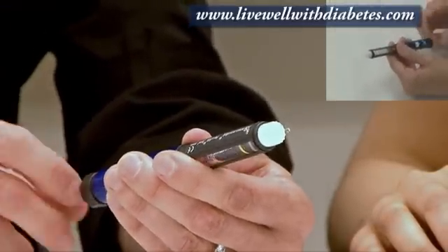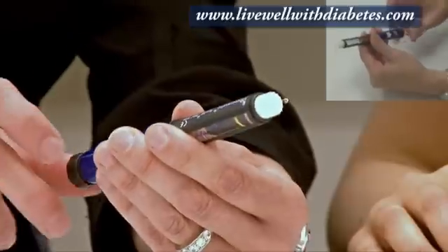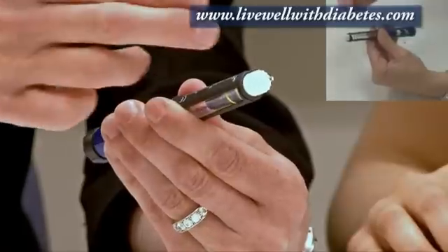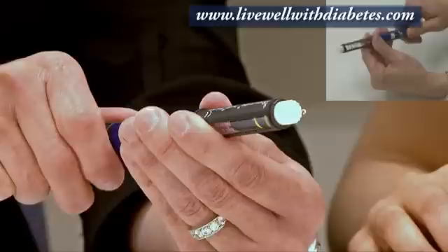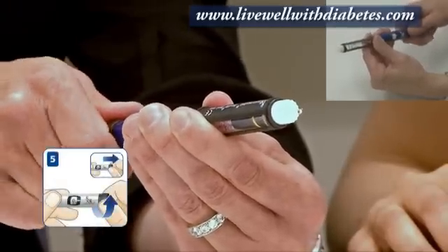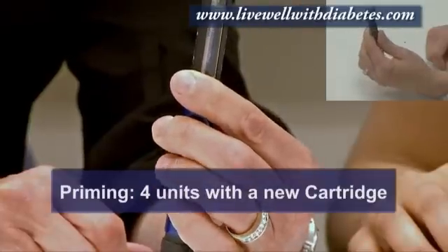Before doing any injection, you prime the pen — it's also called doing a safety check. When starting a brand new tube of insulin, you always turn the dial to number four first: one, two, three, four. Then you hold the needle straight up.